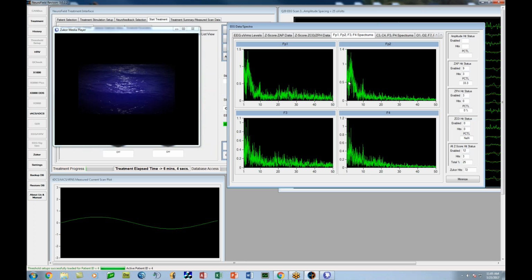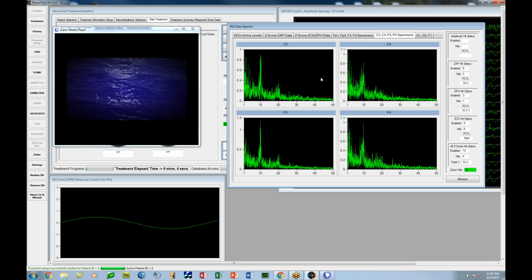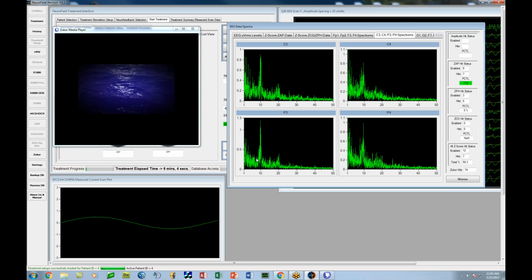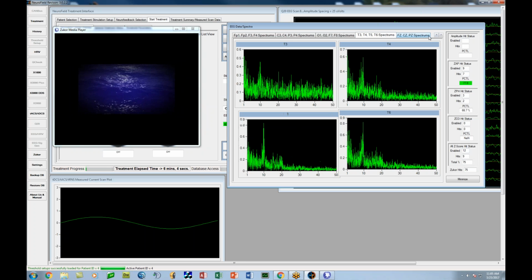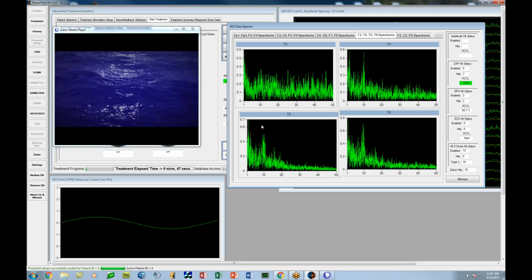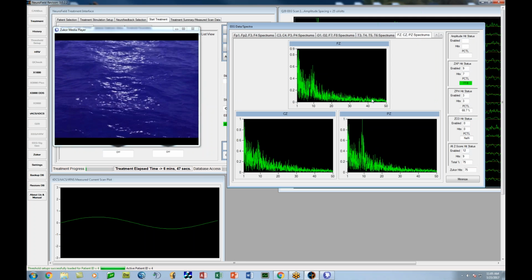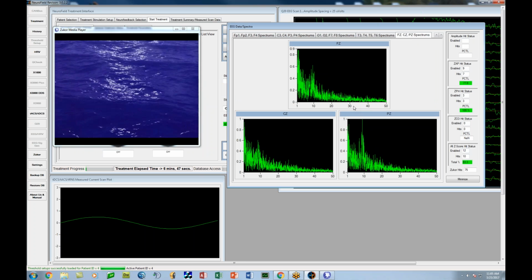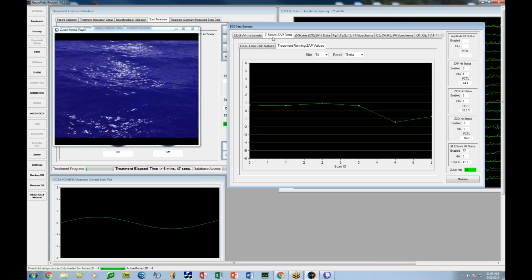Now you could also look at frequency spectrums for each specific site. And it's really fascinating to see what's happening as a person receives stimulation. We're noting some really interesting responses in people. And you can see the peak alpha here appearing, and you see it at O1, O2. And there we go again. There's our T3, T4. Boy, a lot of noise there. And then, of course, we look at our central sites. It's really neat to watch the spectrums move as a person continues to train.